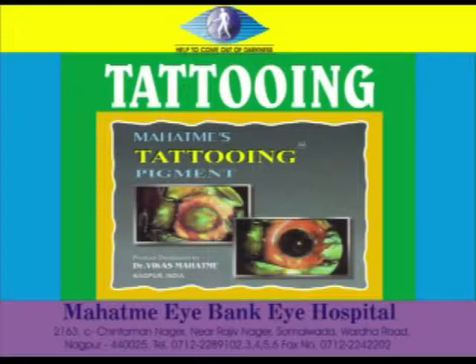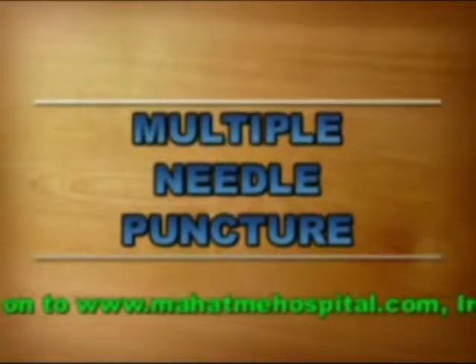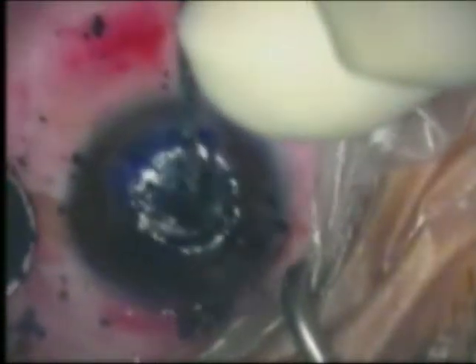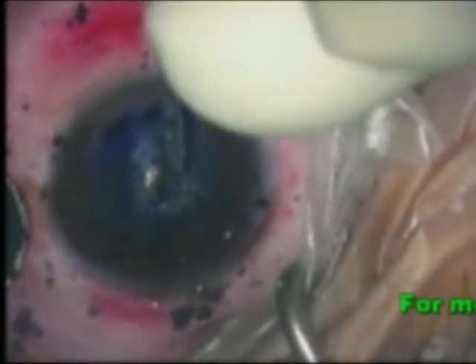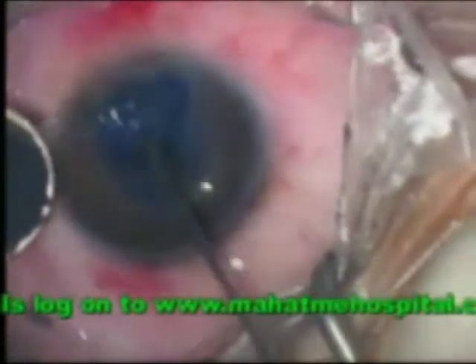Different techniques for tattooing are used for different types of corneal opacities. Let us see the first technique of multiple needle puncture. This is used in opacities which are superficial and not dense, like nebular and macular grade corneal opacities. This involves the spreading of the pigment over the opacity.